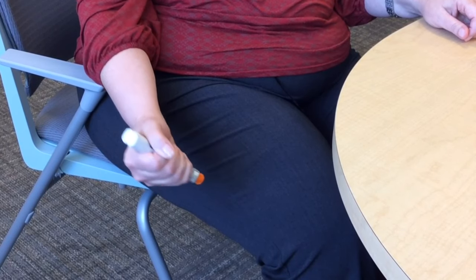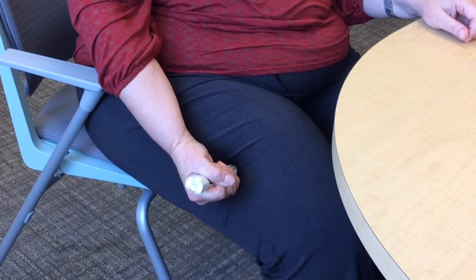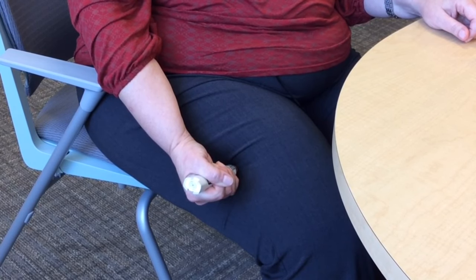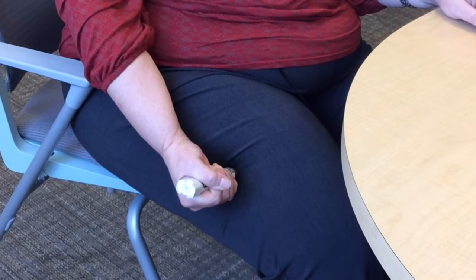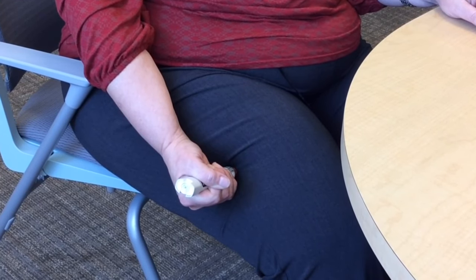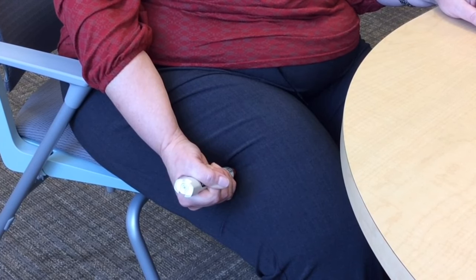Swing and push the auto-injector firmly on the thigh until you hear a click. The click means the injection has started. You may feel some pressure from the auto-injector pushing back — this is expected because the auto-injector is under pressure. Hold it tightly and firmly in place for three seconds.